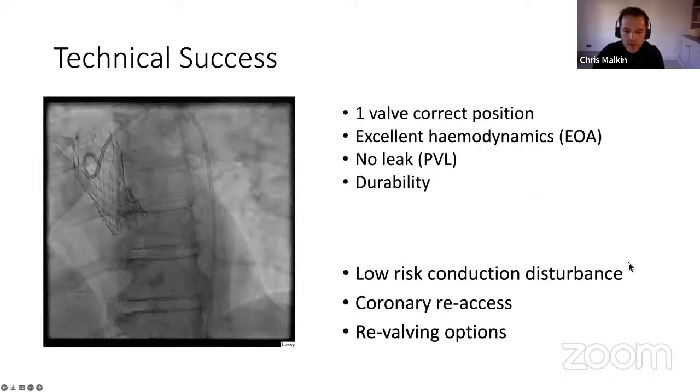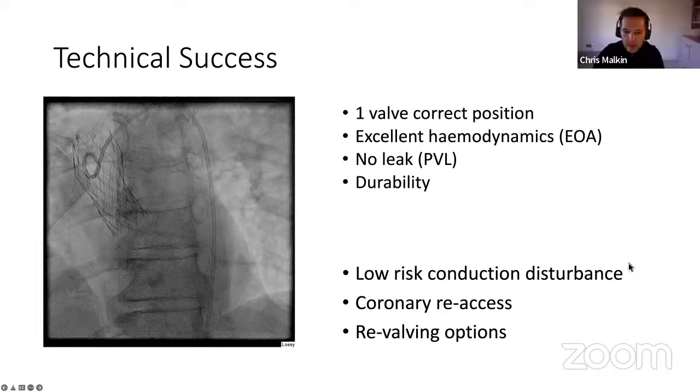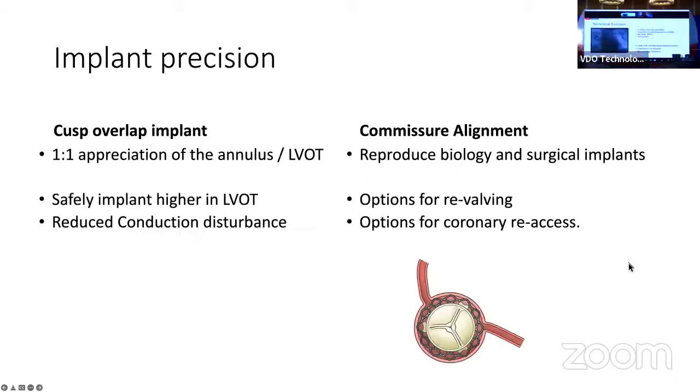For those of us that do TAVI, we have moved on from just hoping that we get the valve working in the body. It's not just getting good hemodynamics with no leak. We're now interested in durability. We're interested in making sure that conduction disturbance, coronary access, and the future options for revalving are all in play. And that requires some specific maneuvers at the time of implant.